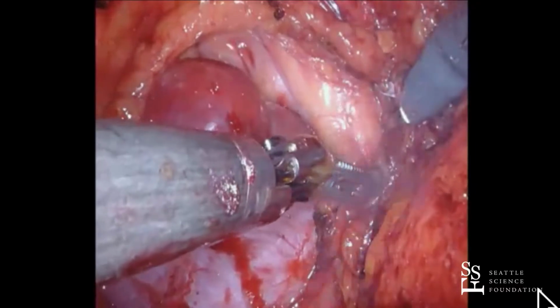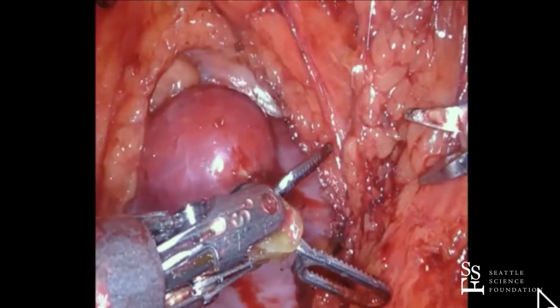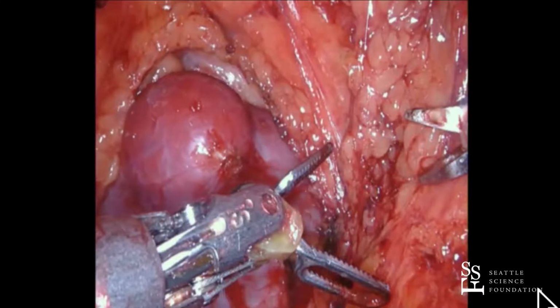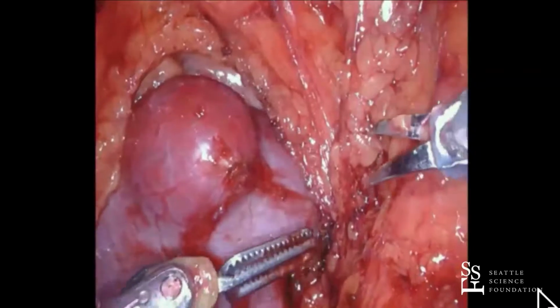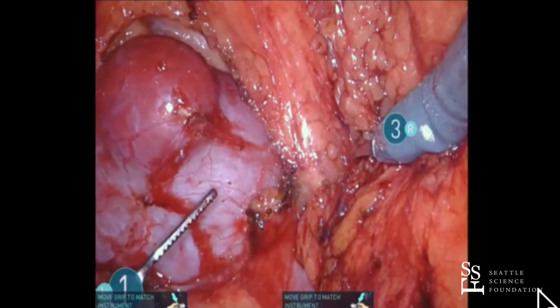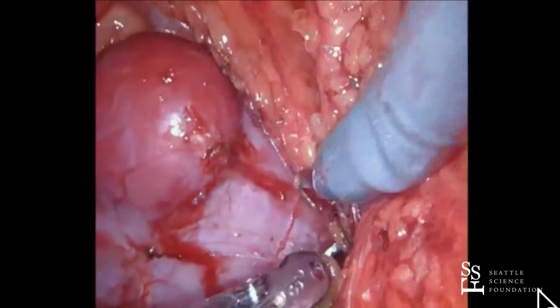I was just going to look down and see what I'm using. I think I'm using Classic 40 watts, and on my bipolar I'm using soft coag, 80 watts, auto stop off. I don't use any cut. I never use cutting current. So I'm using the Classic 40 watt. You have two choices on the Classic, one and two, and I'm using the lower setting. And this is different.